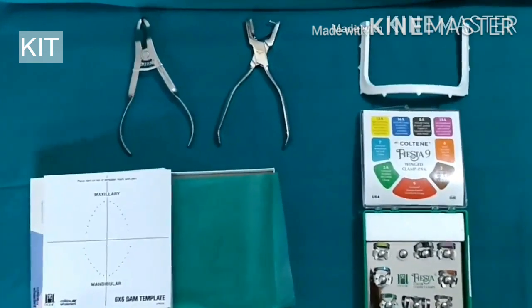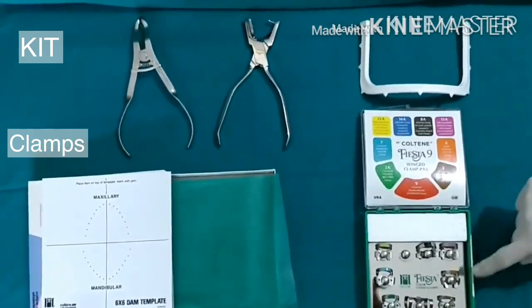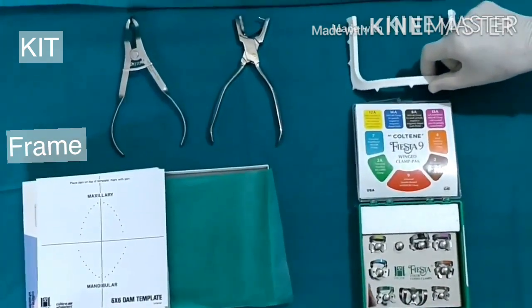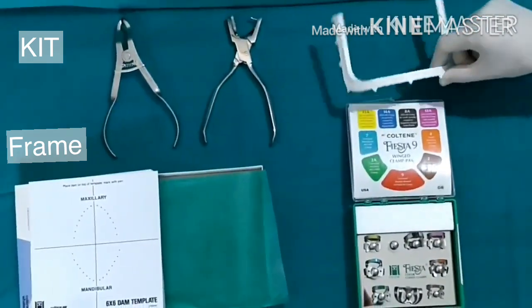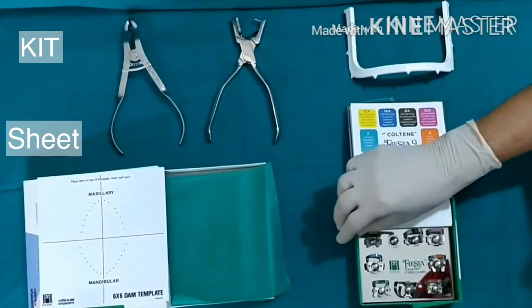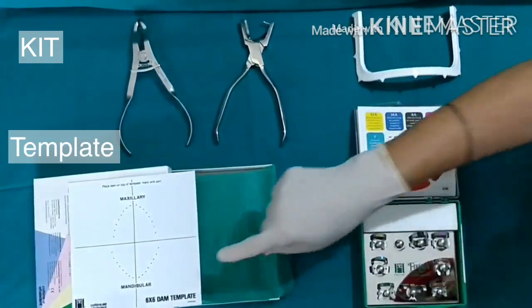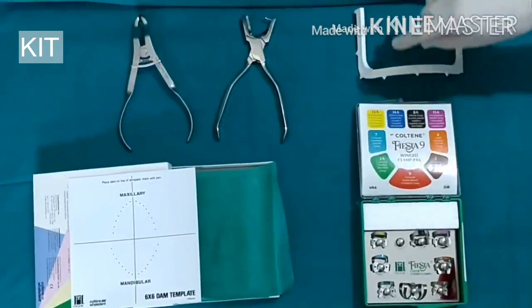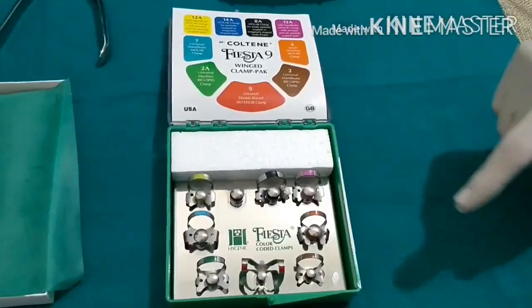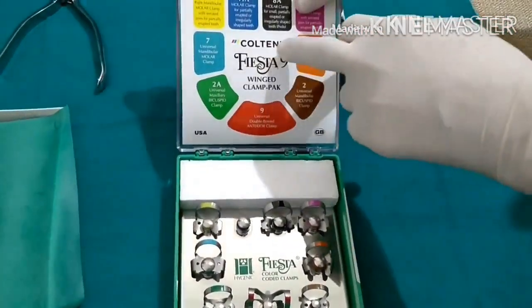When you buy a rubber dam kit it has six items: rubber dam clamps for different widths for maxillary as well as mandibular teeth, a rubber dam frame, a rubber dam sheet which is six inches by six inches, a rubber dam template, a rubber dam punch, and rubber dam forceps.